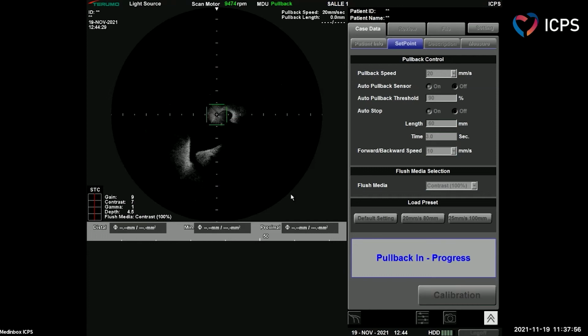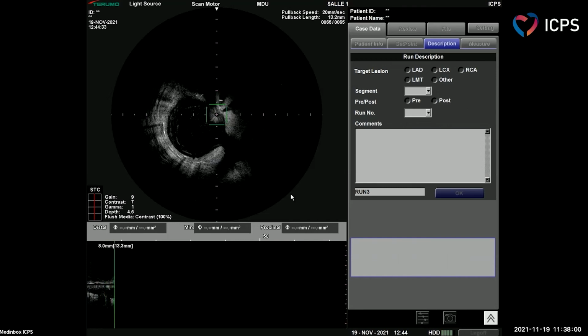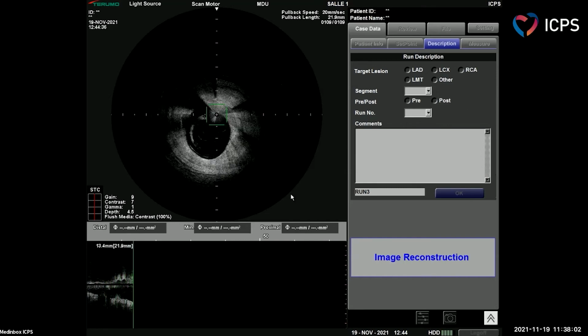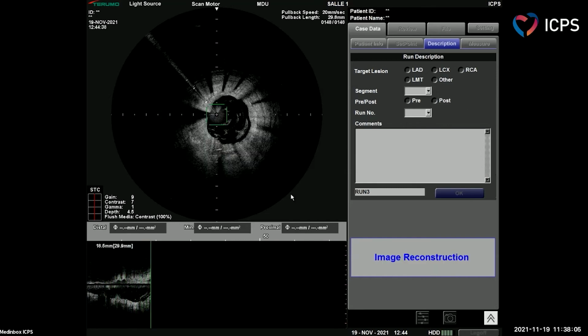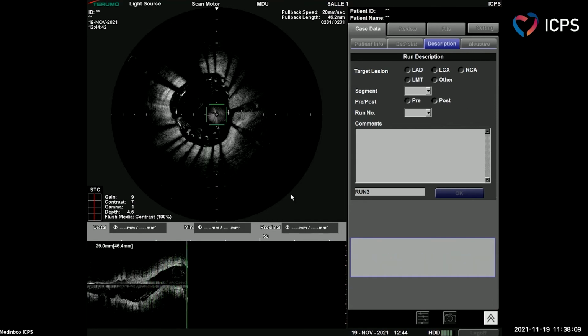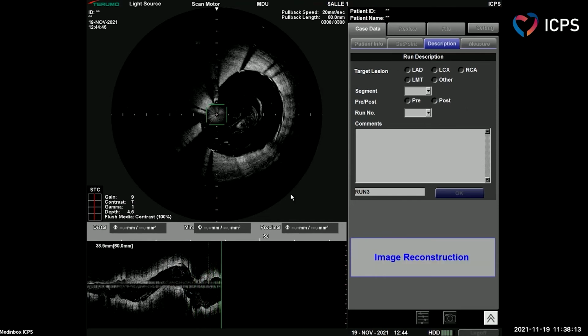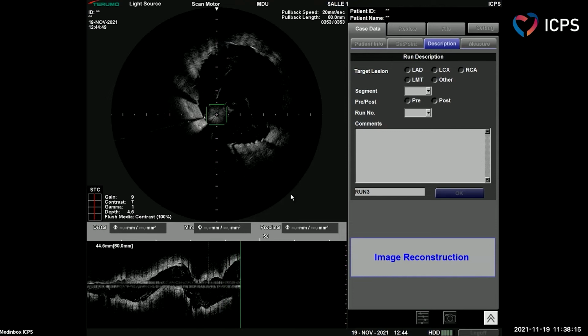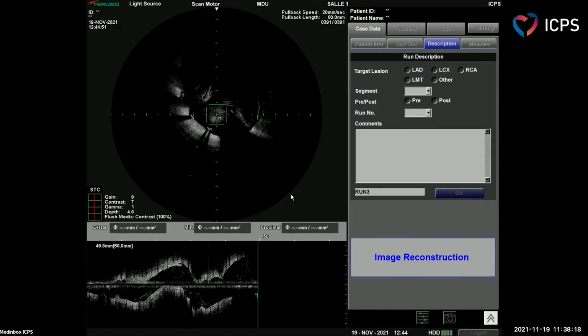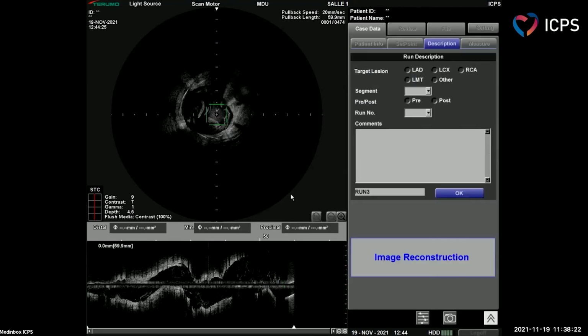Okay. So I see some malposition, I agree, during the pullback. So we'll see. This is the old stent. So this is the proximal. And we see that the apposition within the left main seems very nice, as you can see now. But there was a real malposition in the LAD. And in fact, it's the polygon of confluence, which is not fully apposed.